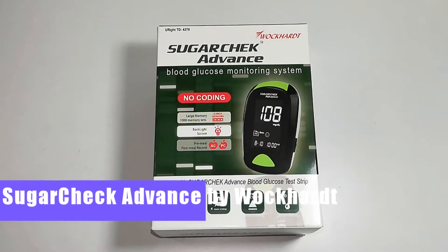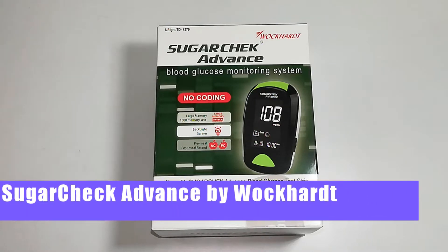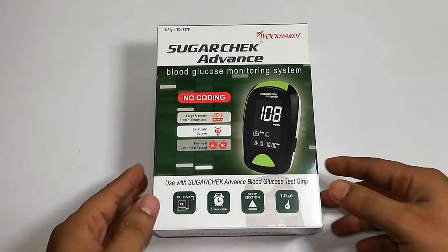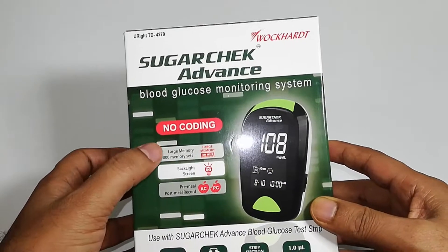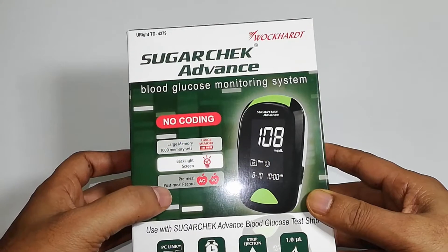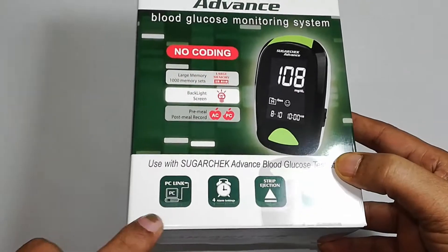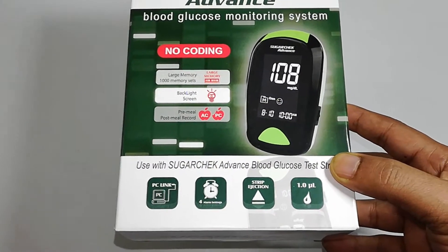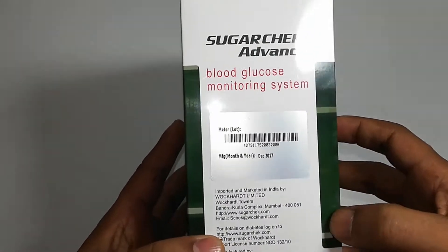Hey guys, welcome back again. Today we are going to unbox the blood glucose monitoring system by Wockhardt — it's called SugarCheck Advance. This is a new packet. Reviewing the packet, it says: large memory, backlit screen, pre and post meal records, it can maintain no coding, and it can also be connected to your PC to record data through a USB drive.